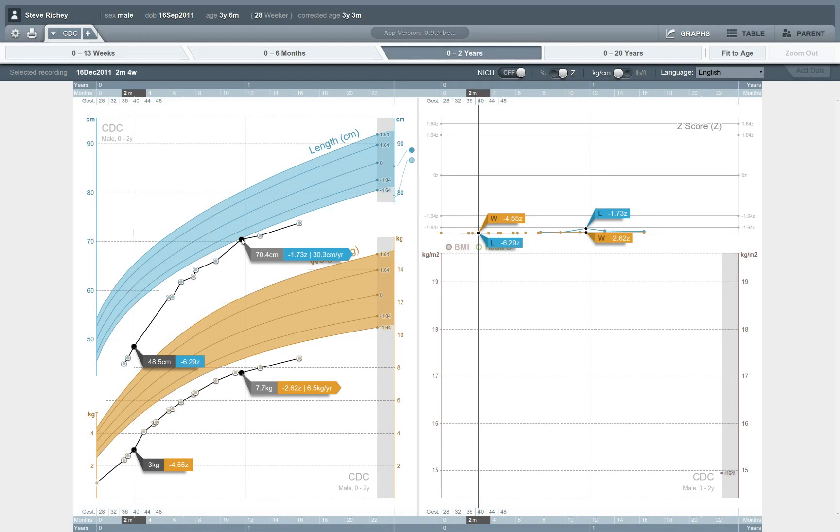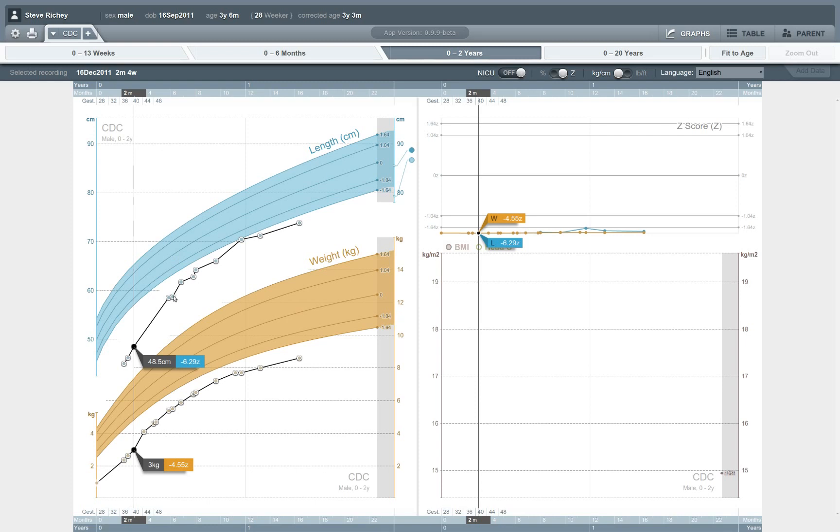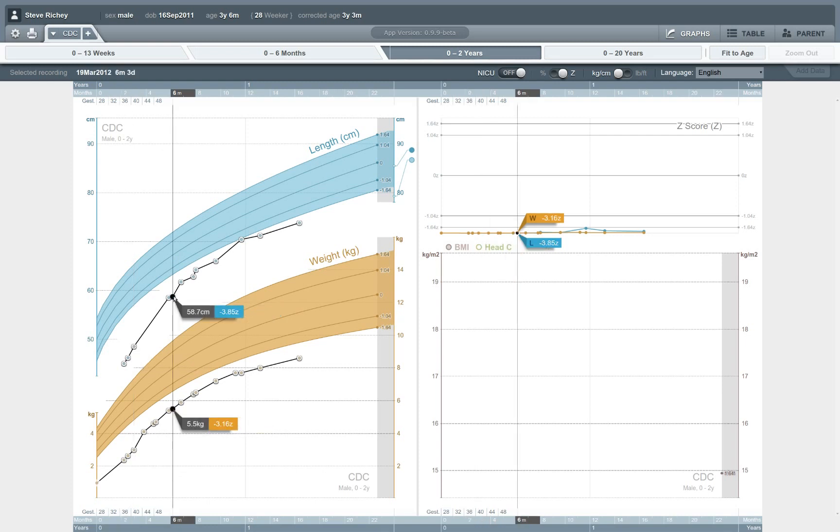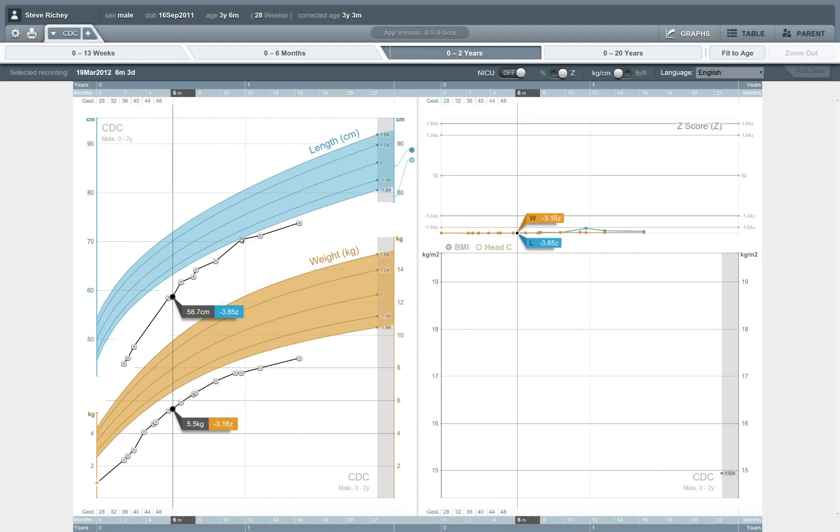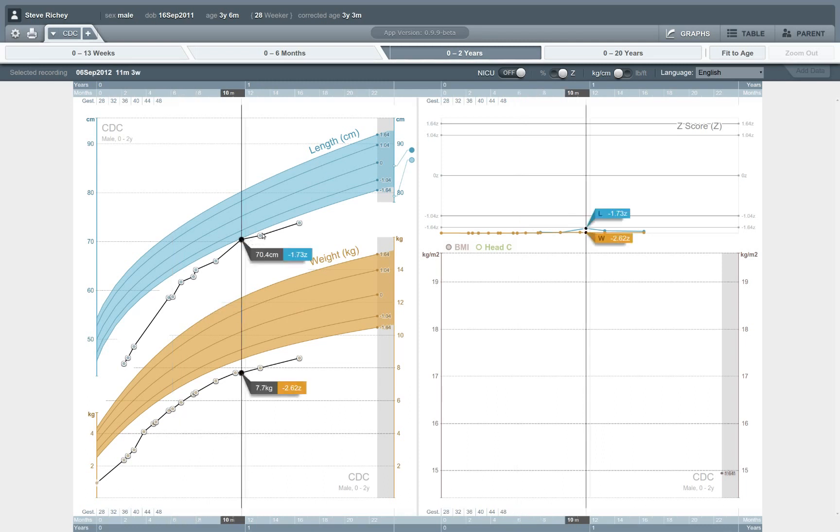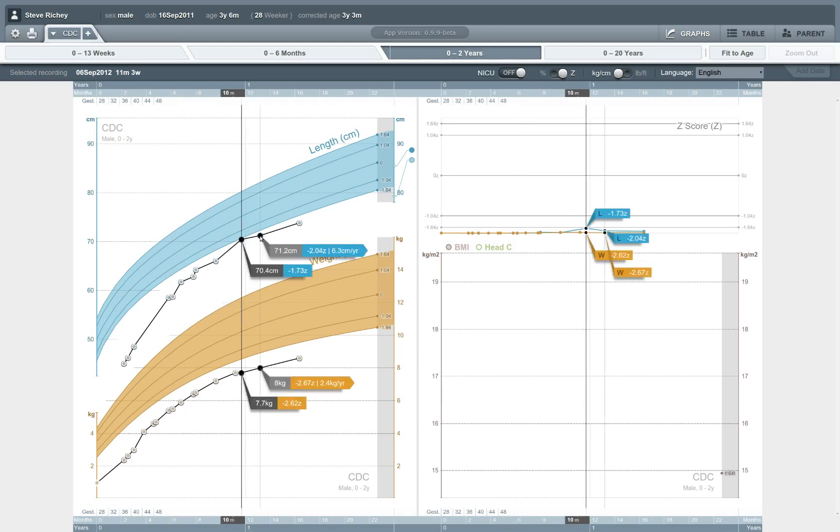Again, an example of a feature that's really valuable for clinicians who may be used to a paper-based workflow where these features aren't available. Just to provide another example, we can also calculate the growth velocity between two arbitrary points by clicking and hovering over another point. We can see the growth velocity here is 53 centimeters per year. Or if we look at a later segment of time here, the growth velocity is slower. We can see the slope is lower and the growth velocity is 6.3 centimeters per year.